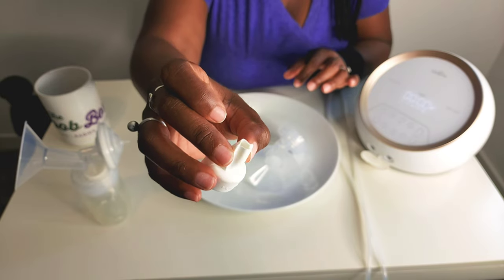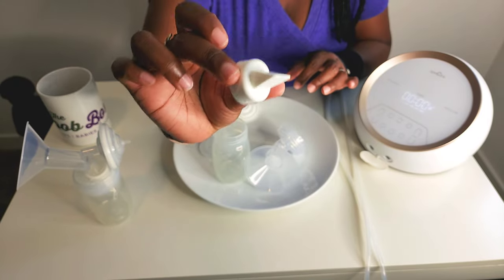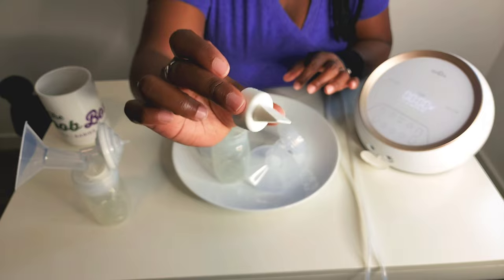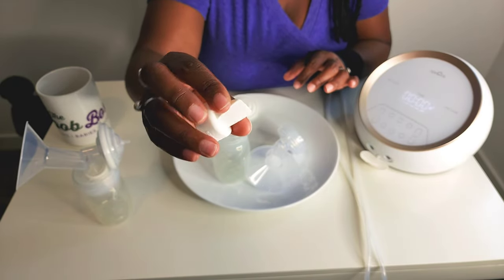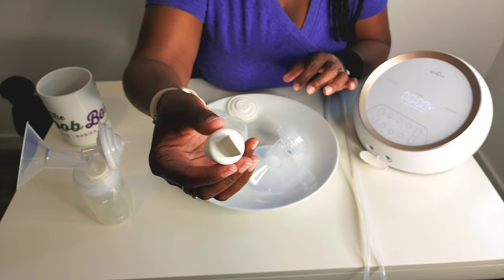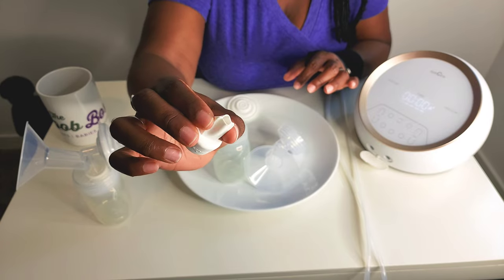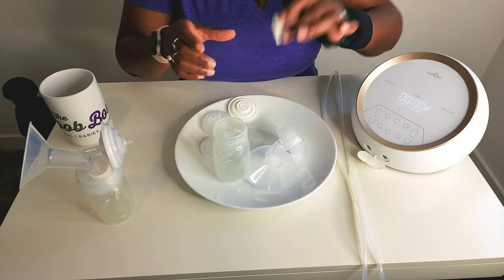A lot of people say to me, "Rue, I just don't get it. My pump is not working." And I'm like, have you checked your duckbill? You need to replace these every month to every 3 months, depending on how often you pump. If you're an everyday, all-day pumper, you're probably going to want to replace these monthly. But if you're an occasional pumper like me, then you can replace these every 2 to 3 months. But always check the integrity of the duckbill before you use it. Okay, so that's your duckbill.